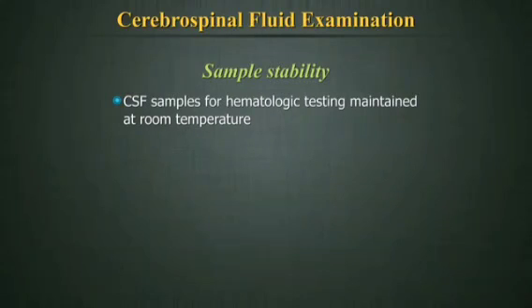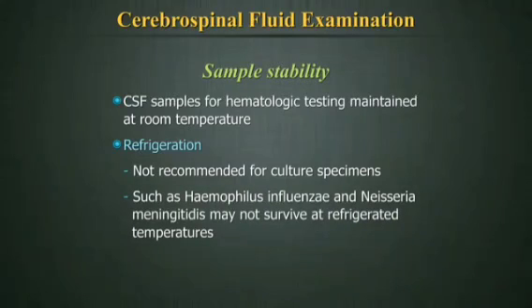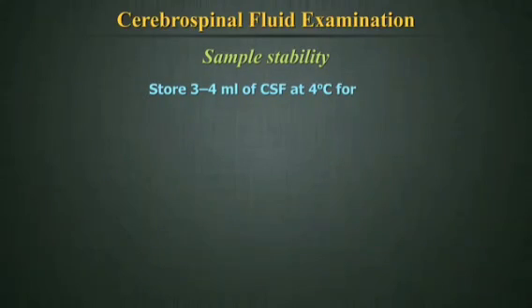CSF samples for hematologic testing should be maintained at room temperature prior to testing. Refrigeration is also not recommended for some culture specimens since fastidious organisms such as Haemophilus influenzae and Neisseria meningitidis may not survive at refrigerated temperatures. Store 3 to 4 milliliters at 4 degrees centigrade.